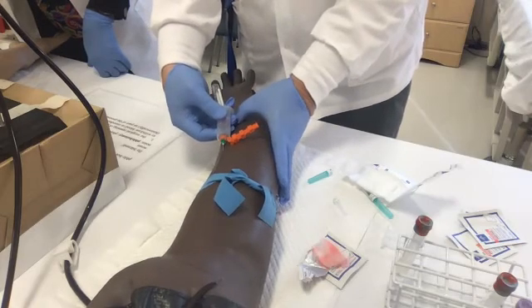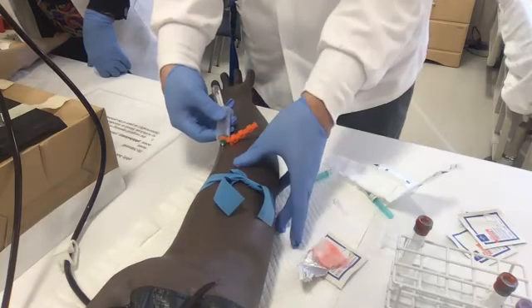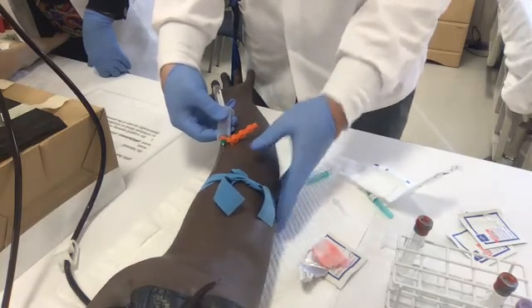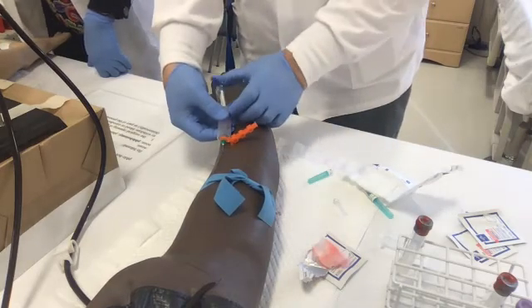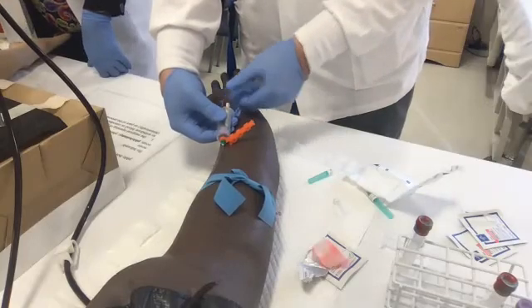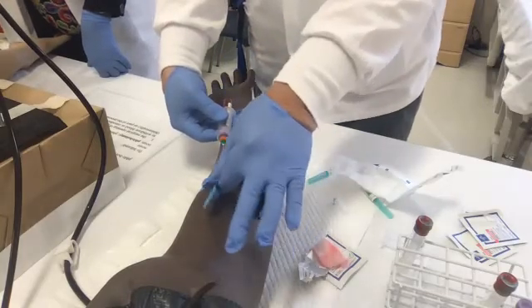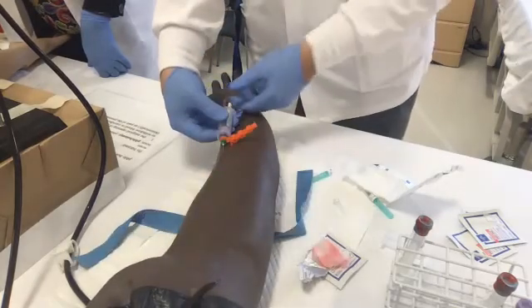And when you put your hand on it like that, you pull the skin taut at the same time? Not really. I just hold it down, because if I pull it down, it might move the vein, especially with my more elderly patient. Okay. Then, boom, I let it fill, right? And now it's filling up with blood. Tourniquet out. And you see how I make sure it falls away to the side.